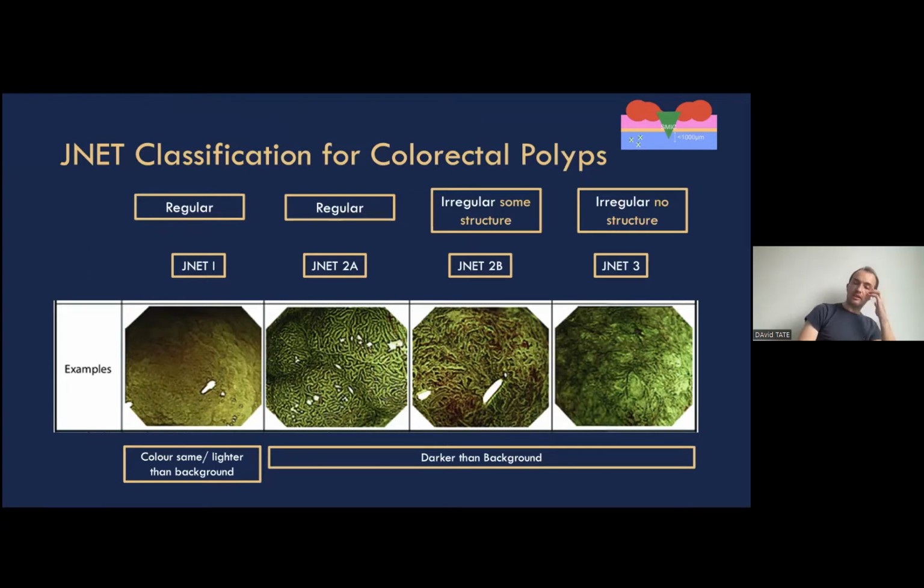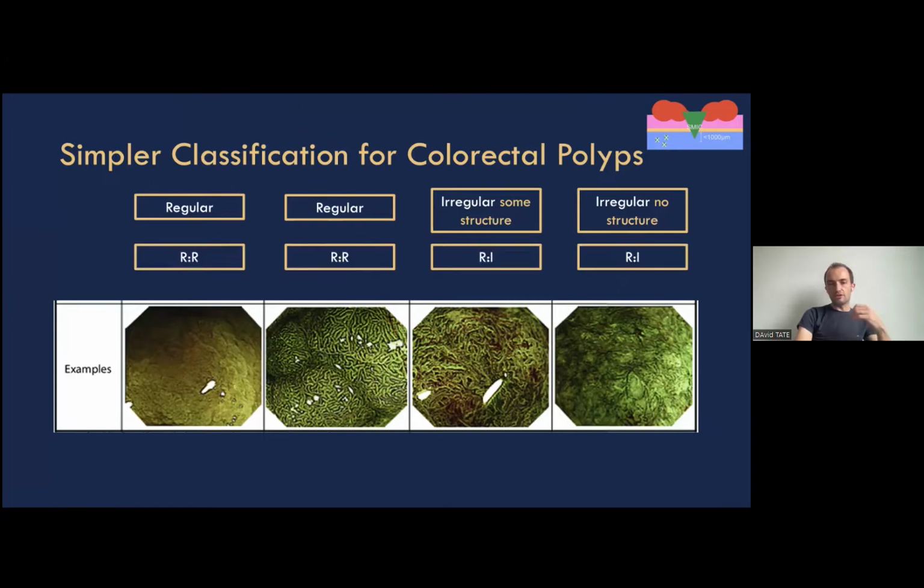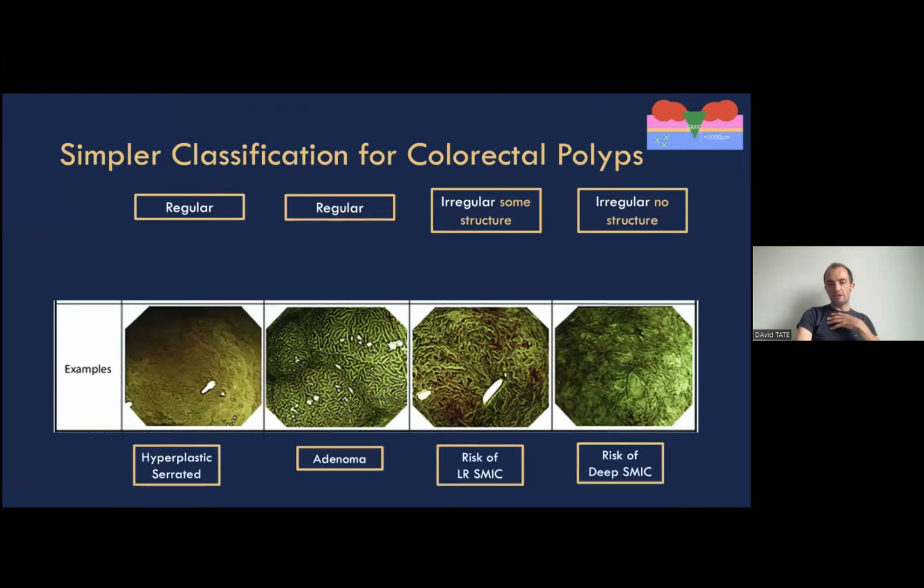Now you might say, well, you're telling me another classification system, that's making everything really difficult, but it's not very difficult, because actually you just replace the names JNET with these terms: regular background, but lighter; regular background, but darker. And then irregular with some structure, and you can see that indeed there is some structure maintained, but it's not as regular as this pattern here; and completely irregular. And so that is what we're talking about when we look in a demarcated area, and we will show you multiple examples of that as we go along. But that is a structure that you can use to analyze any demarcated area within a polyp.